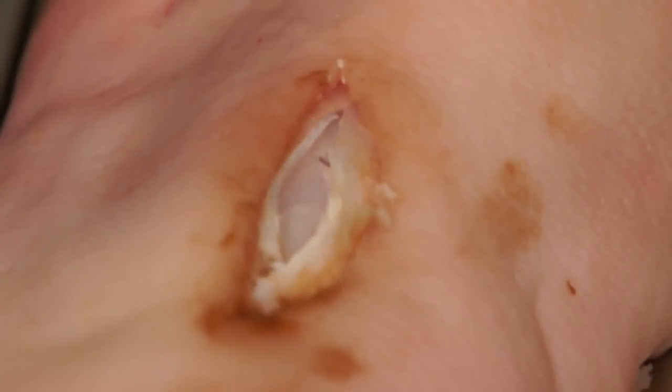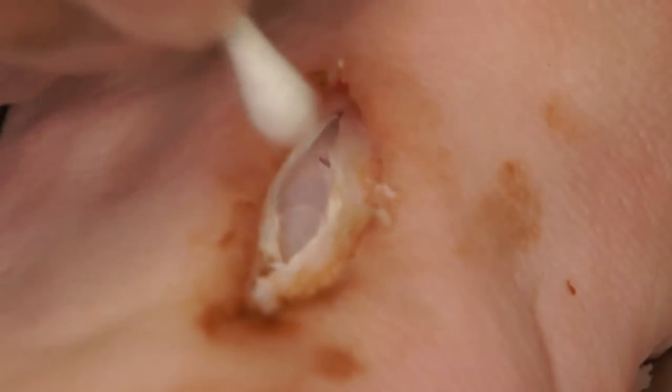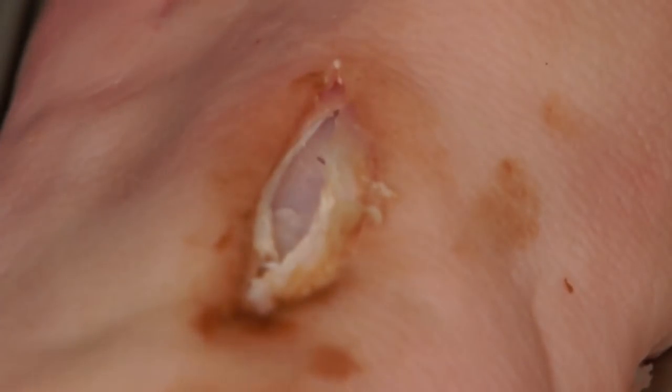This will illustrate the various levels of tissue that may be encountered during a debridement. Initially, one can see the epithelial surface. Immediately underneath this is the subcutaneous tissue. At the base of the wound, one can see the muscle level. Just immediately above that, there is a fascial plane.